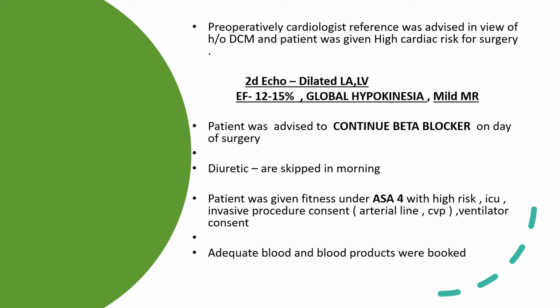mild MR. This case was referred to us after denial from very big institutions. We were really proud of taking this case and eventually extubating him and sending him home on day 5. We gave him fitness under ASA 4. We took high-risk consent, invasive procedures consent such as arterial line and CVP line, and obviously post-op ventilator consent was also taken. We booked adequate blood and blood products.